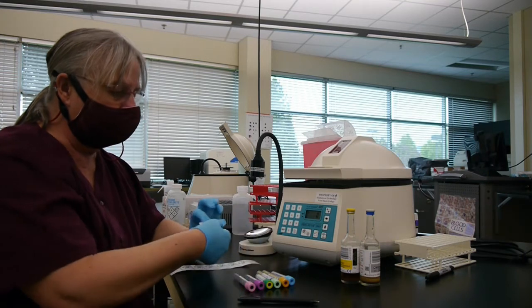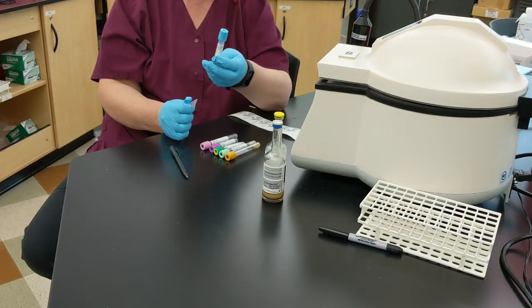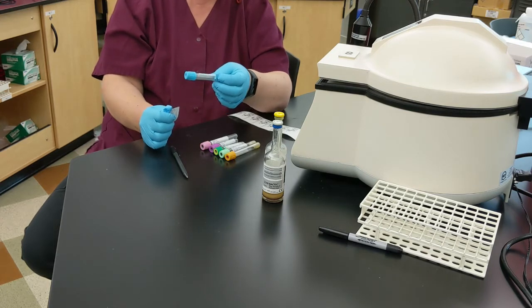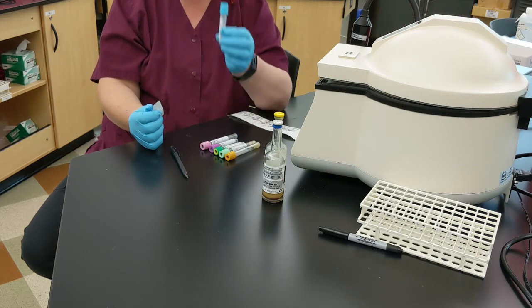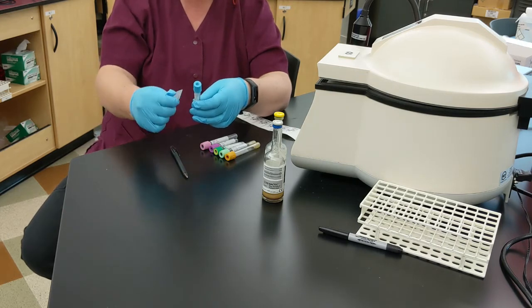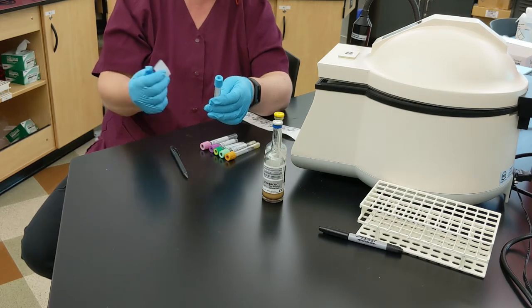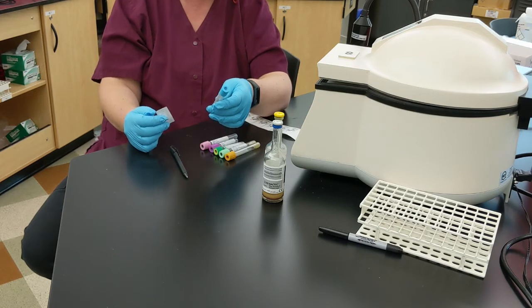People do the darndest things with labels — they wrap it around, put it crooked, or don't put them on at all. Crooked is better than no label, but many times we're putting the tube onto an analyzer and the analyzer is scanning the barcode. If the barcode is not quite right, it can't be read, and then we have to spend more time adjusting it, which also delays patient results.